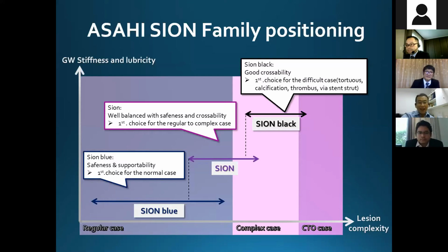Yeah. For me, I still wonder about the hydrophilic guide wire, especially the polymer jacket coat in side branch protection in the first practice of my intervention. Since there are some examples of the hydrophilic polymer jacket coating guide wire in puncture situations, which you use with a needle that has a very sharp edge.